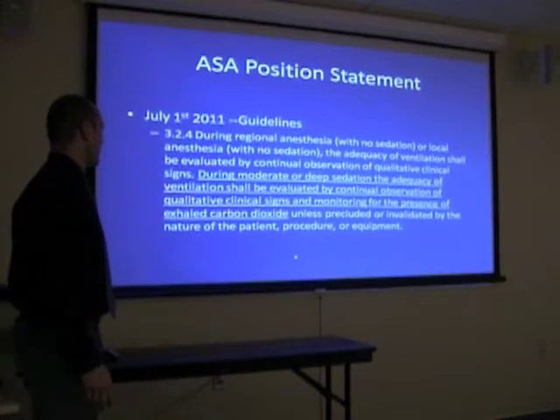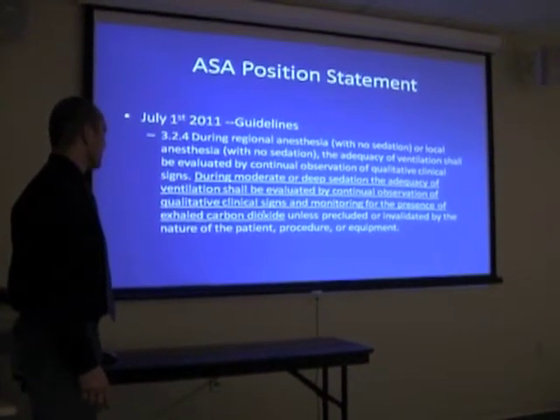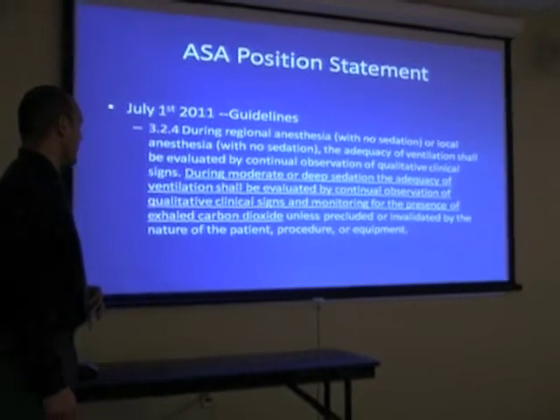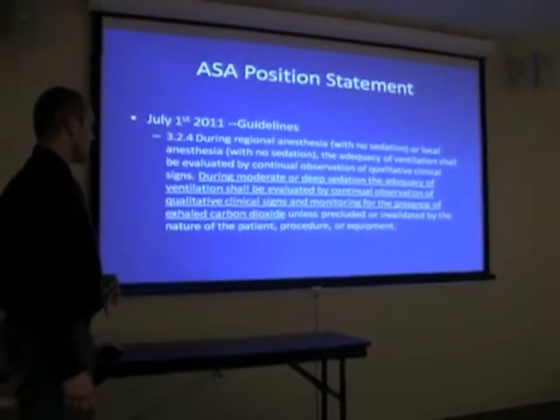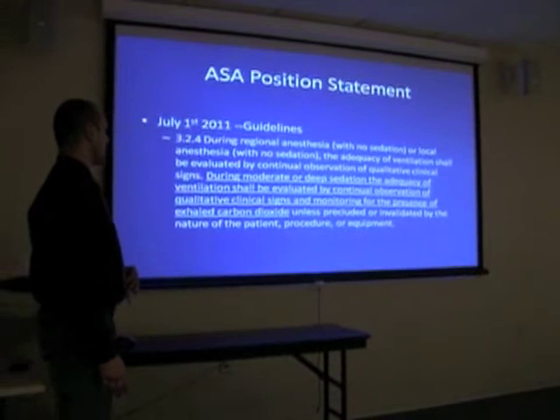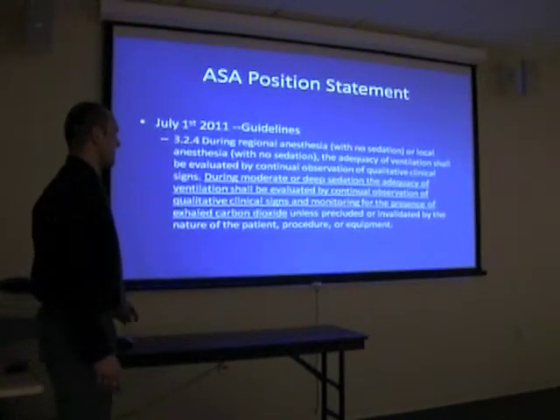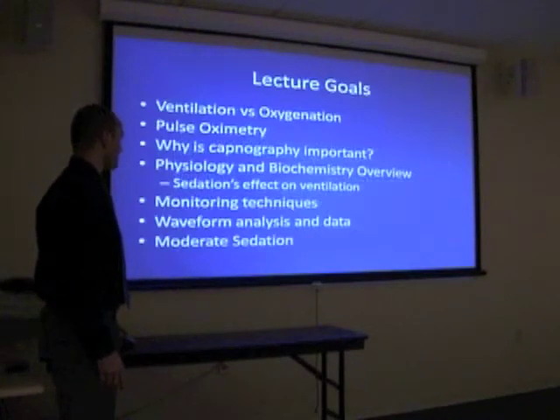And I really just highlighted the part that's most important to you guys: during moderate or deep sedation, the adequacy of ventilation shall be evaluated by continual observation of qualitative clinical signs and monitoring for the presence, and that's an important part, the presence of exhaled carbon dioxide. And we'll get into why those certain parts of that statement are important.